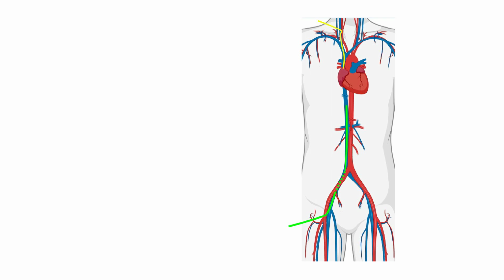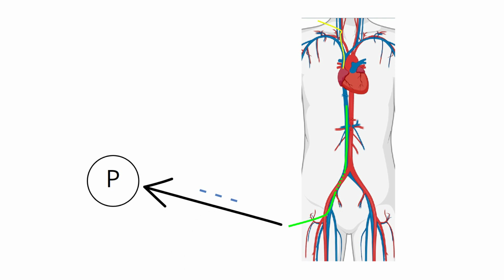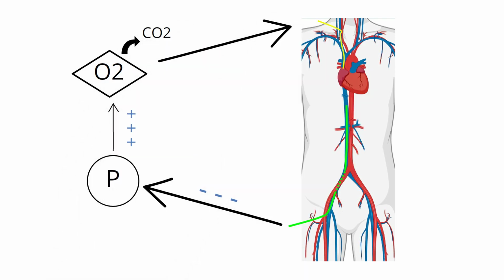Blood is drained via the venous cannula in the femoral vein, flows into the ECMO pump through negative pressure or suction, gets pushed by the pump through the oxygenator where the blood undergoes gas exchange, and then flows back through the return cannula to the right atrium and is dispersed through the lungs and out to the body by the patient's native cardiac function. Oxygenation is controlled by the FiO2 and blood flow, and carbon dioxide is controlled by the sweep gas flow rate.